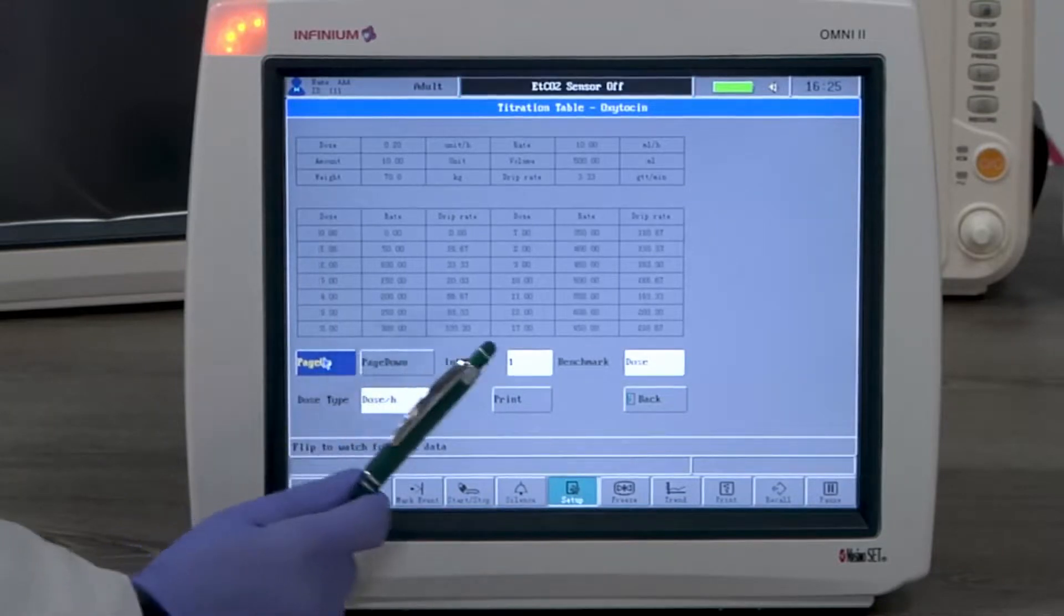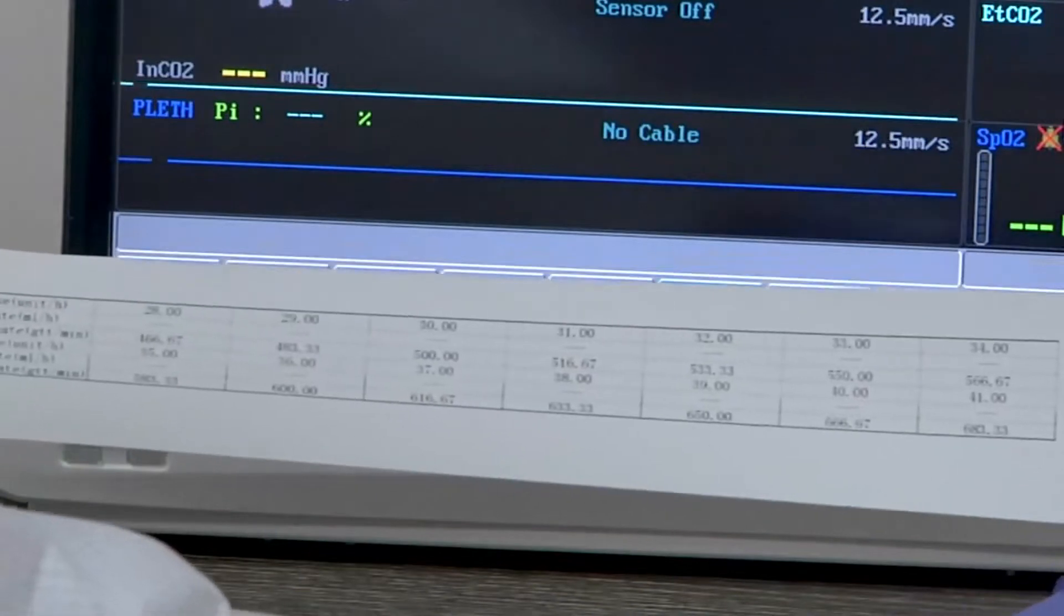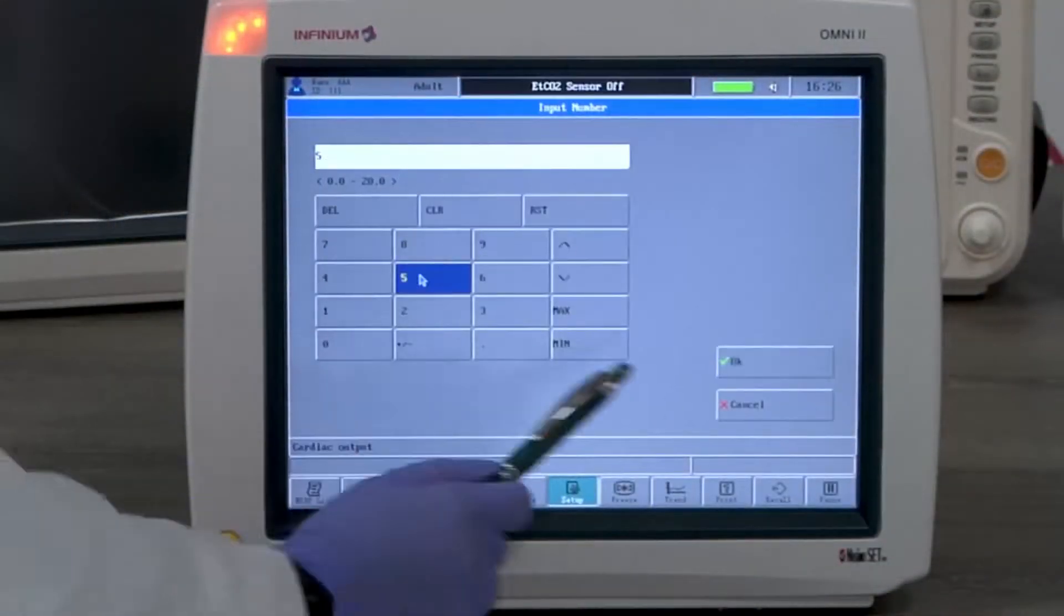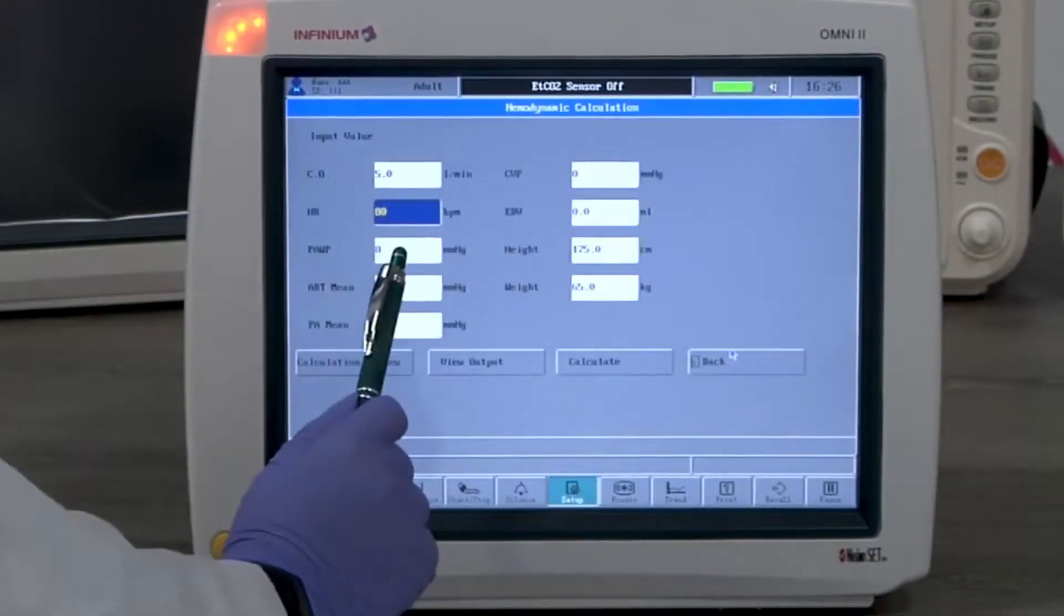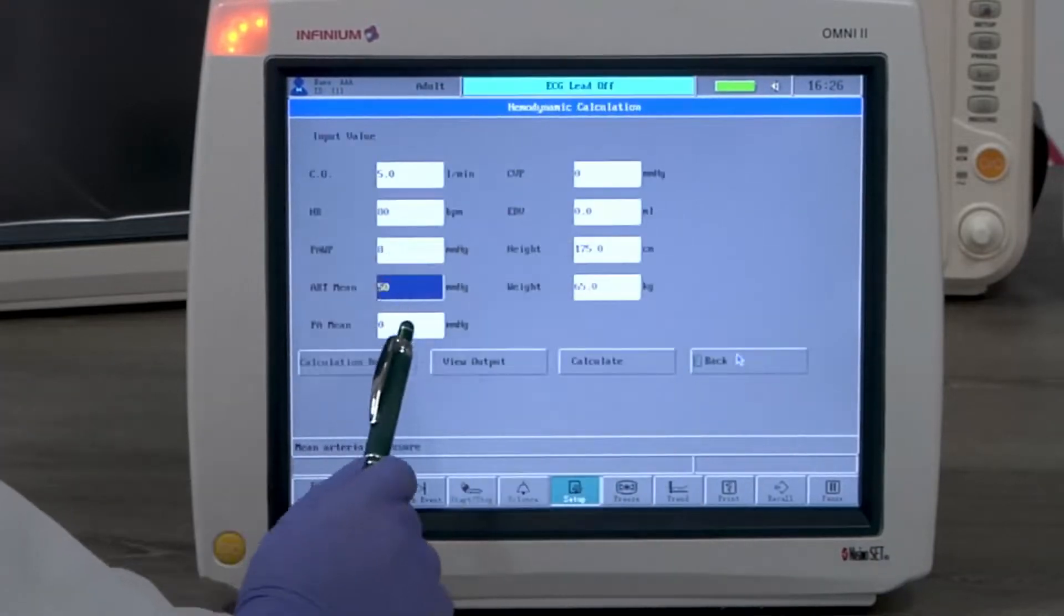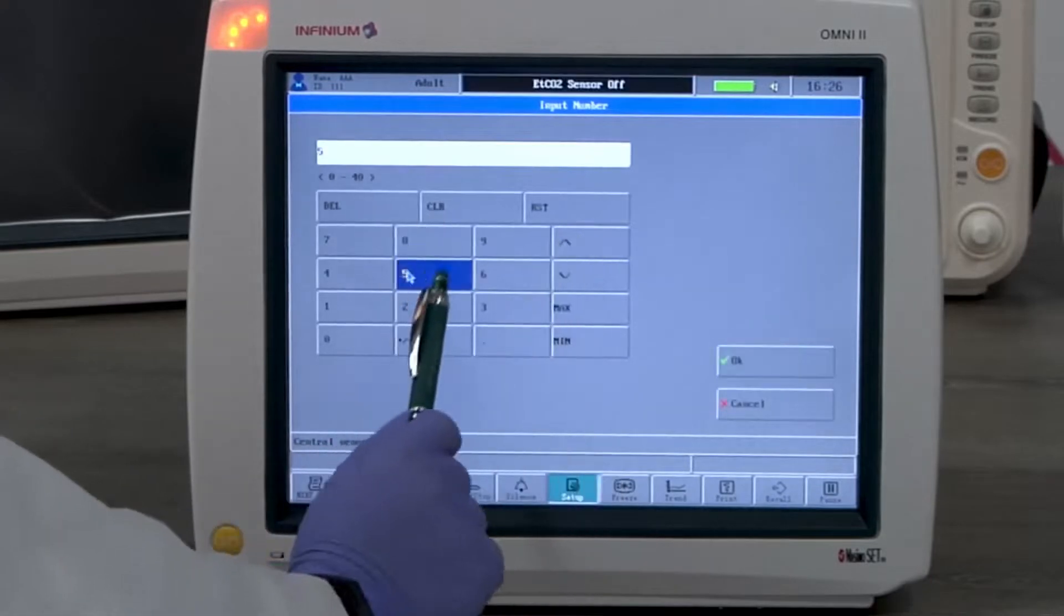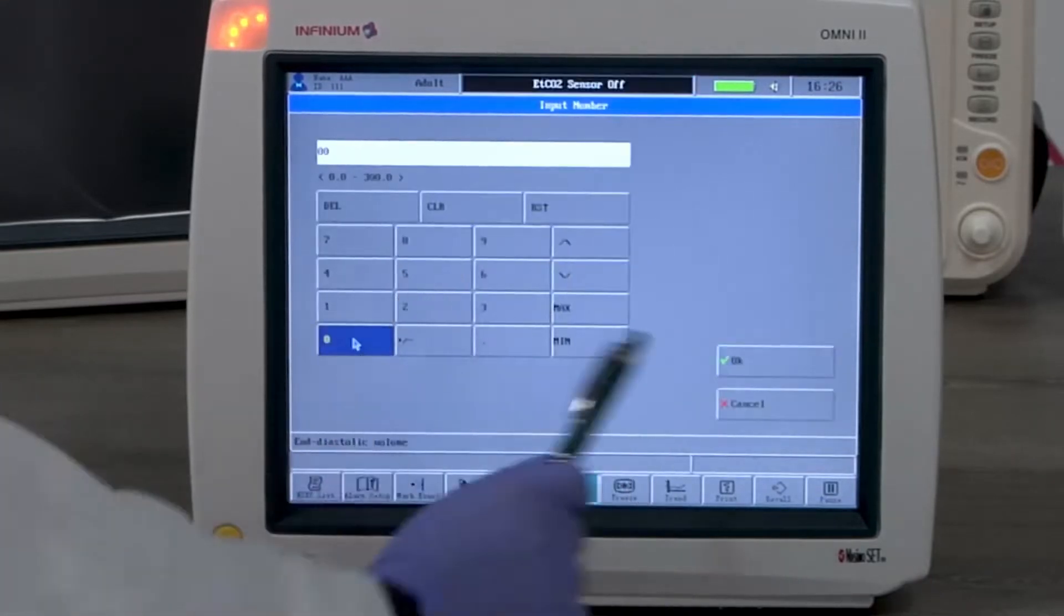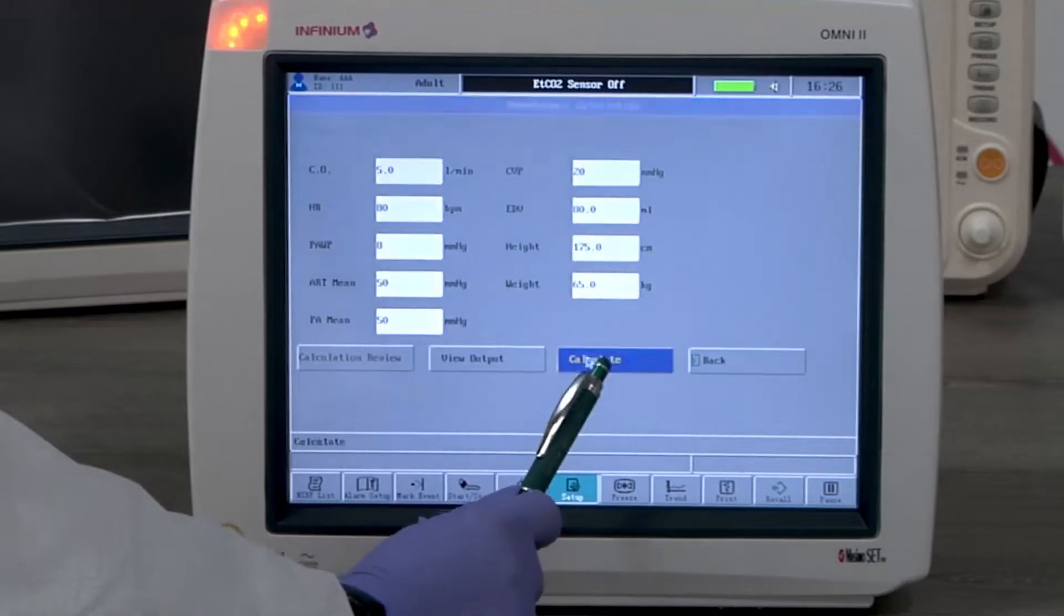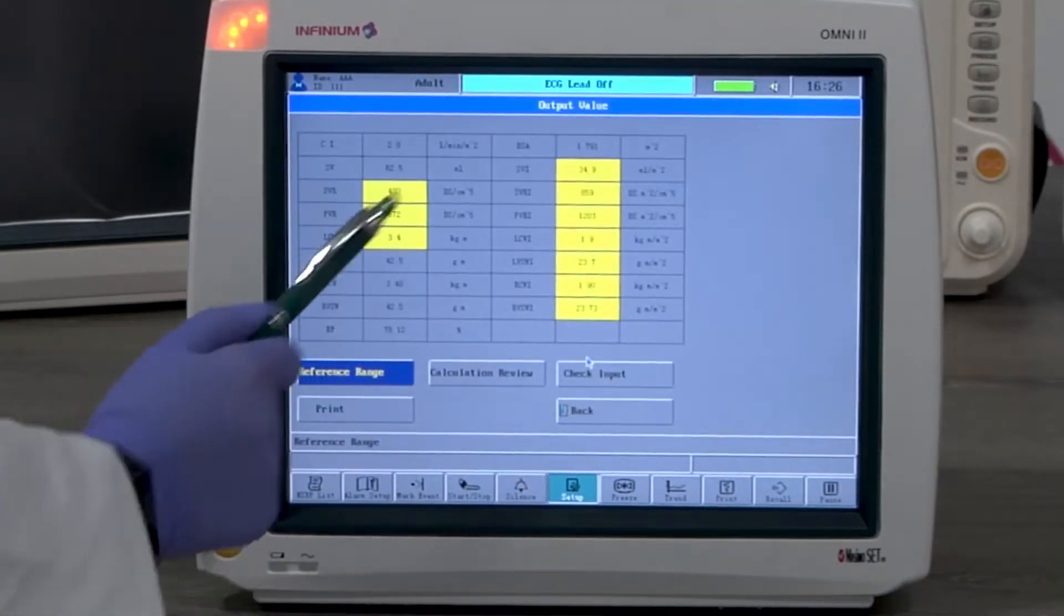Hemodynamic calculation is also a calculation feature. It'll calculate most clinically relevant hemodynamic parameters. You only need to input all the required readings, then select view output or calculate to see the result.